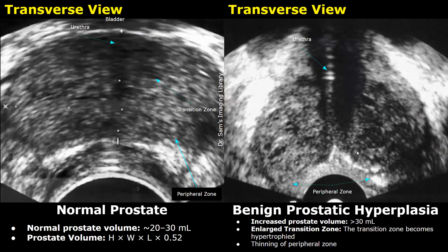Here is another image of benign prostatic hyperplasia. The prostate gland is enlarged with enlargement of the transition zone and thinning of the peripheral zone. The gland becomes more hypoechoic and heterogeneous. Sometimes you may find a hypoechoic boundary between the transition zone and the peripheral zone — this boundary is called the surgical capsule.